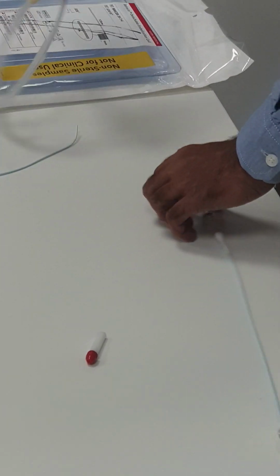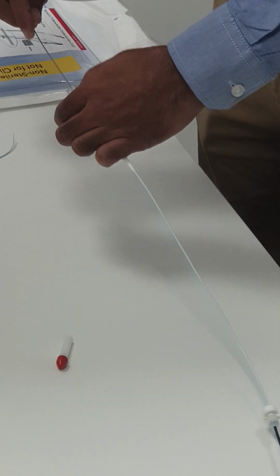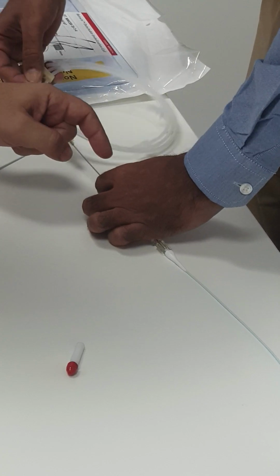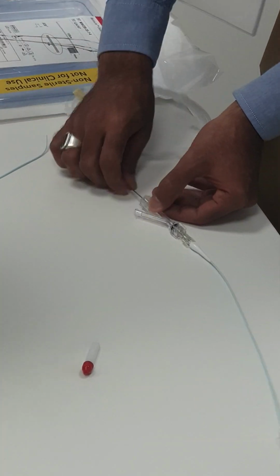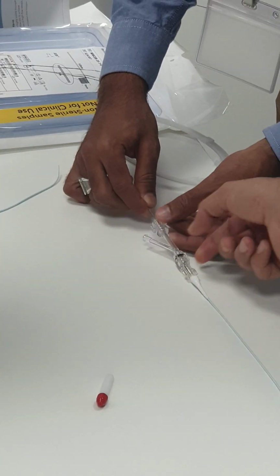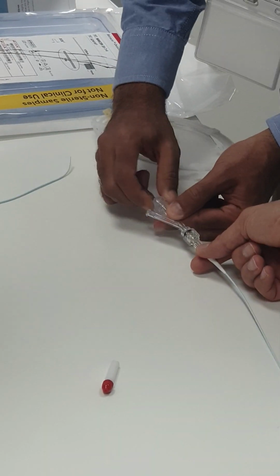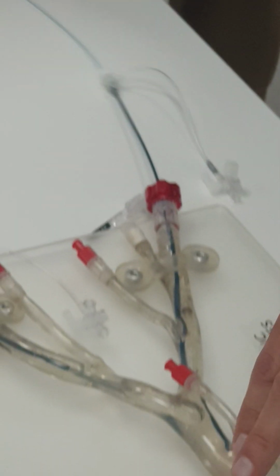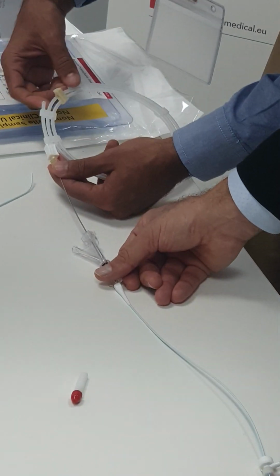So if you are in trouble, you have a vessel which is bleeding, you have the tool to stop bleeding. Just hub it here, exactly, hub it here, and then close, to keep the position. And keep your system straight. Watch your catheter there, the position is not changing, the whole system is relaxed and straight.